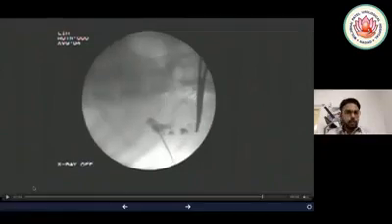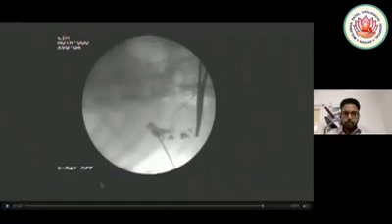Yeah, correct. So I think you have highlighted and demonstrated how the puncture can be done. Now I want to ask Dr. Guido and then subsequently Dr. Mahesh Desai. First, I want to ask Dr. Guido that you saw the puncture in the upper calyx and you also demonstrated in your talk that upper calyx can be easily punctured. It is not a big problem for supine PCNL.